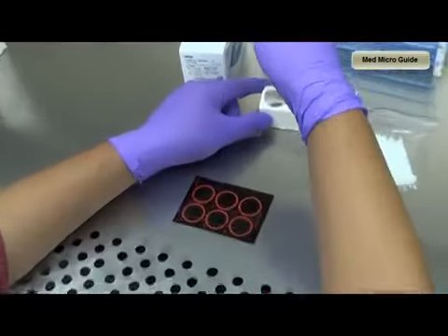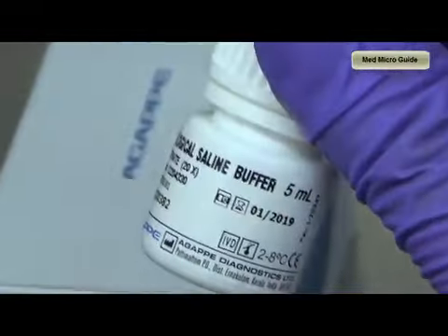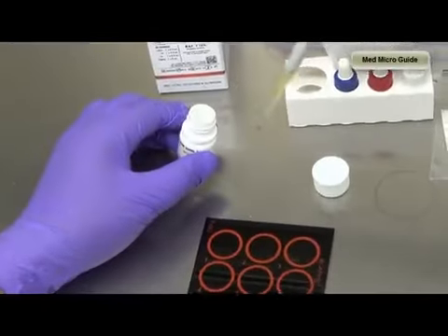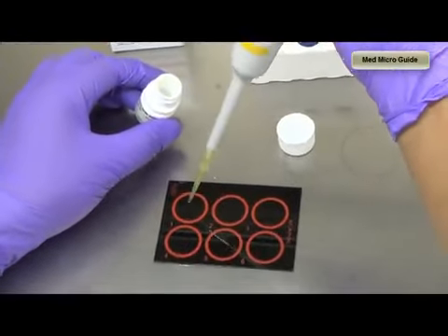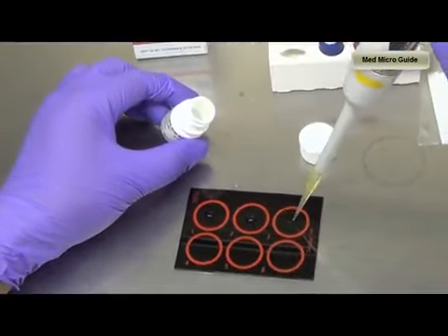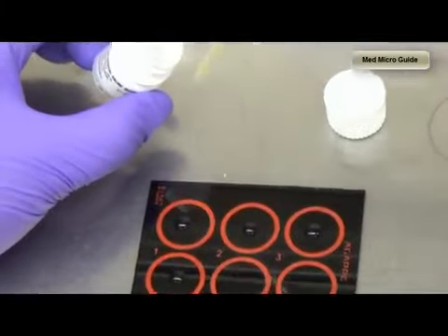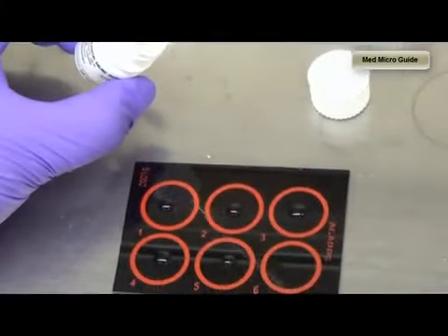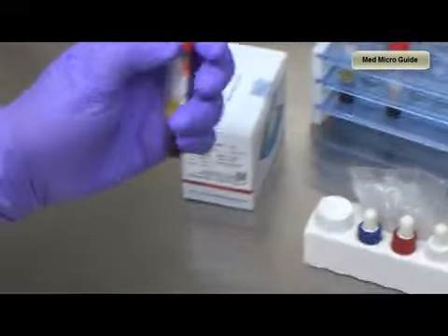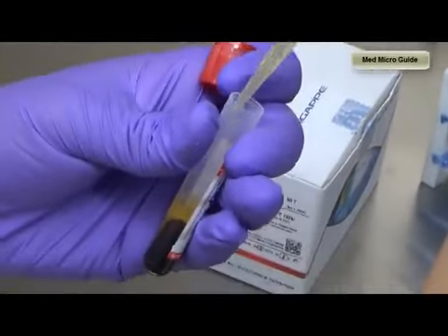If the qualitative test is positive, then we have to continue with the semi-quantitative estimation of the ASO. Semi-quantitative estimation of ASO is done by diluting the serum with physiological saline buffer. The physiological saline buffer provided will be 20x concentration, hence we need to dilute the buffer before we use it. 50 microliters of 1x buffer is added to each of the 6 circles in which we are going to dilute the test serum. To the first circle, we will add 50 microliters of the serum.